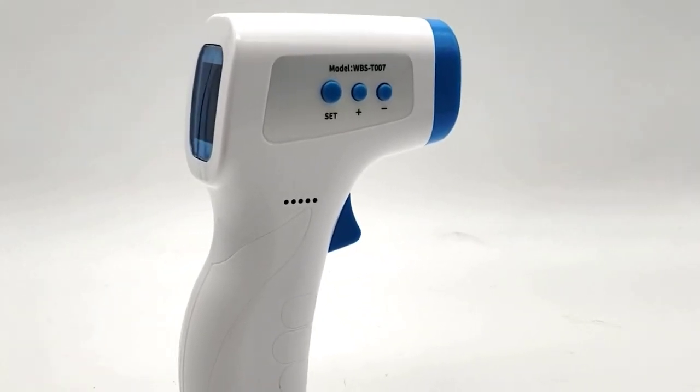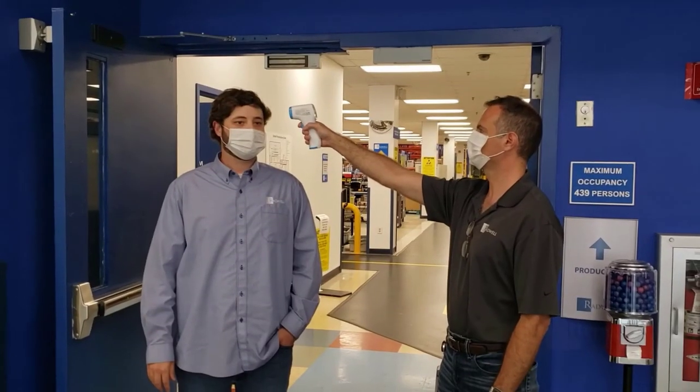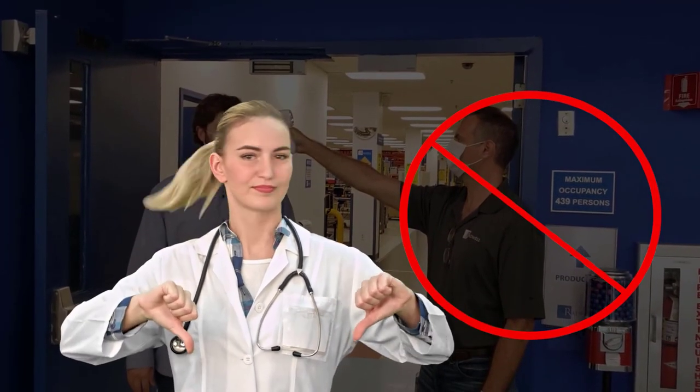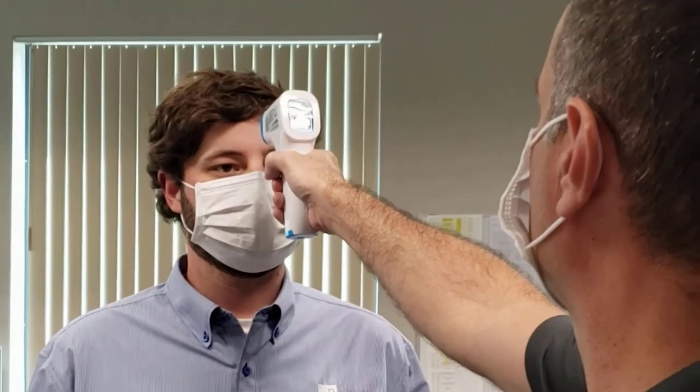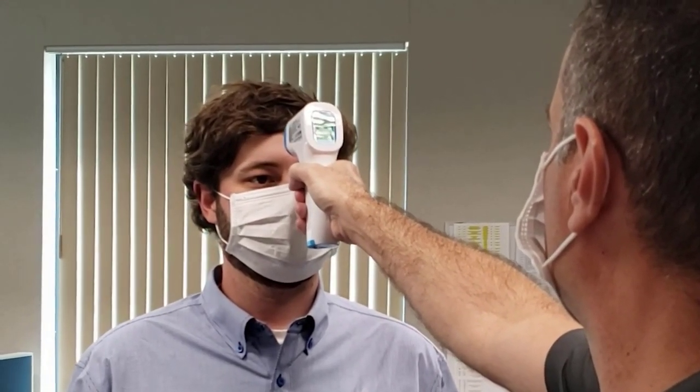There are some important recommendations to be aware of when operating this thermometer. The thermometer should be used in a stable environment and not in a doorway or in any setting where there are frequent temperature changes. The device should be pointed at the forehead without the participant sweating or having hair over the forehead.